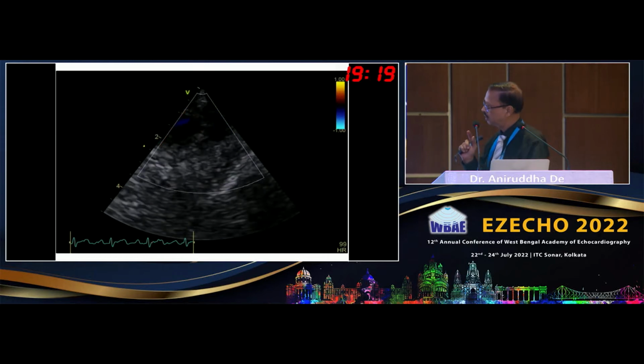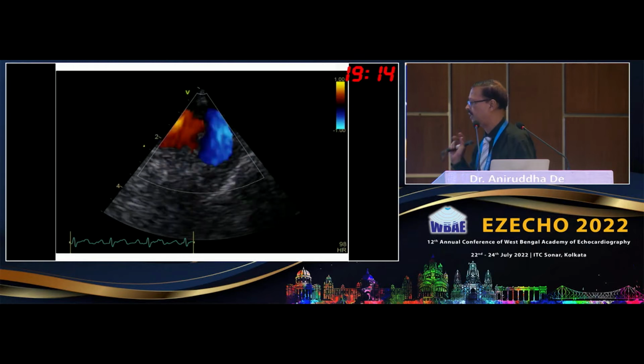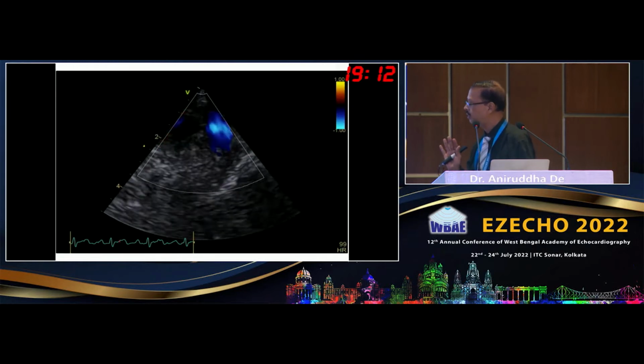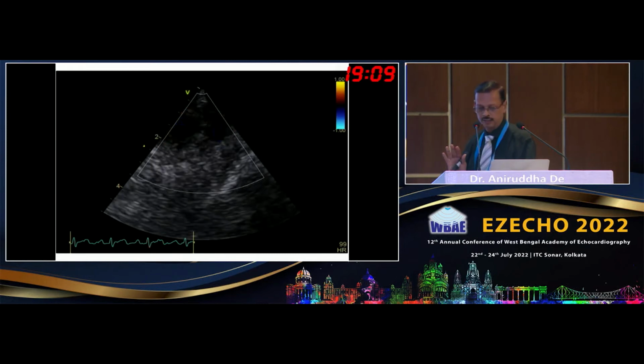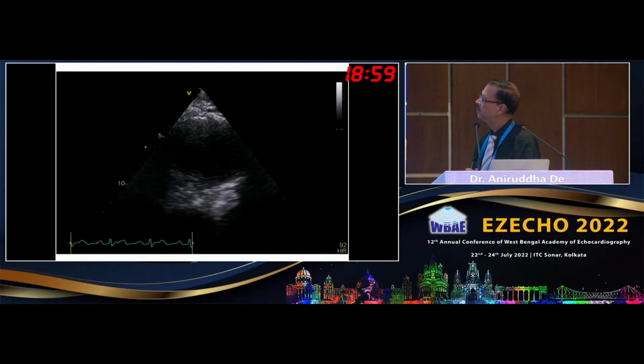Then I saw a little bit of swelling in the patient clinically in the left infraclavicular area. The patient did not say anything. Then I put the Doppler in the descending aorta, and there is no diastolic flow. And this is the picture I saw in the left infraclavicular area. You see, this is pulsatile. Putting the probe is not so much, but still it feels pulsatile.